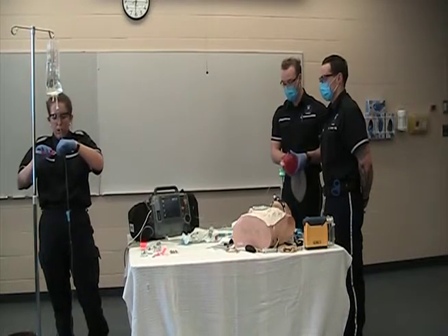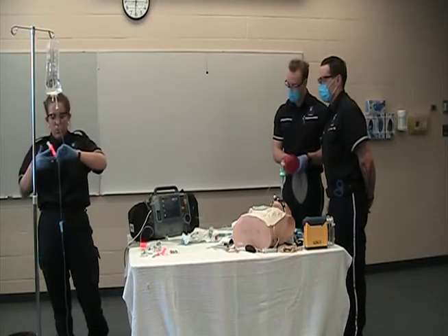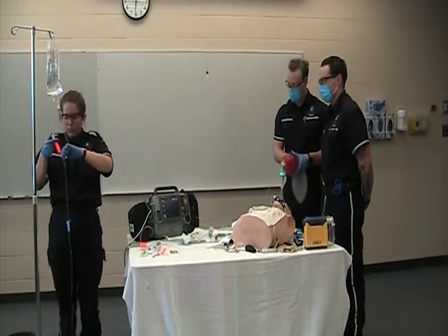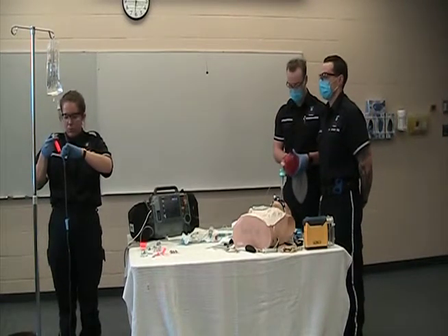And vital signs are okay? Vital signs are good. SpO2 is at 98%, and ETCO2 is at 33. Okay. Heart rate's at 73. Blood pressure is 106 over 70. Perfect.